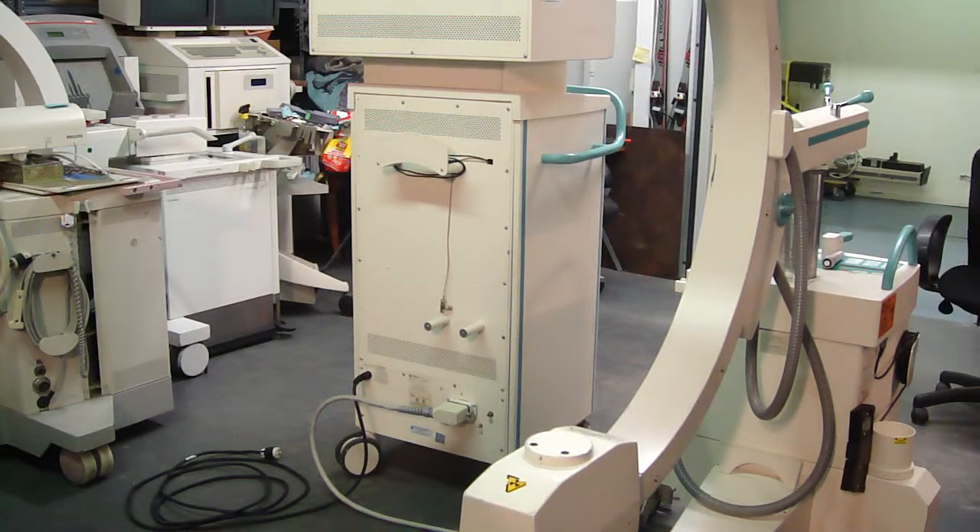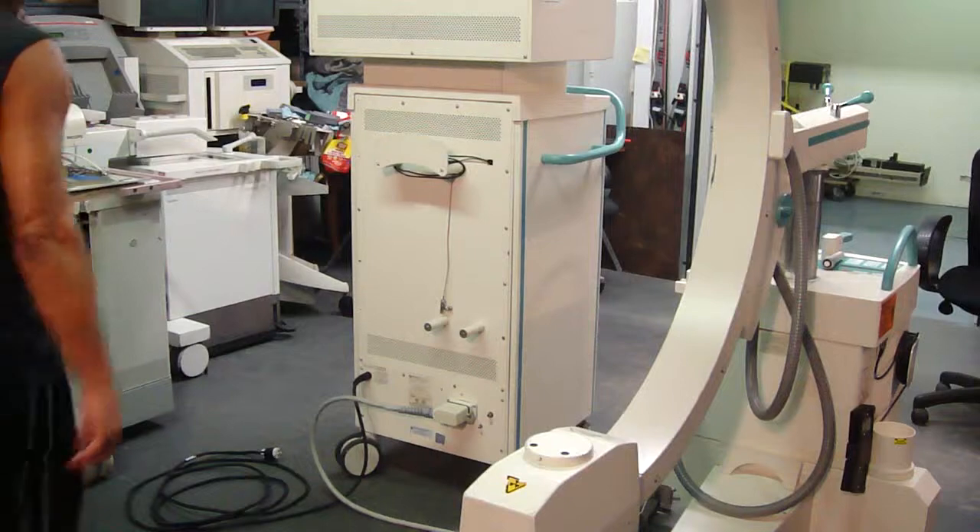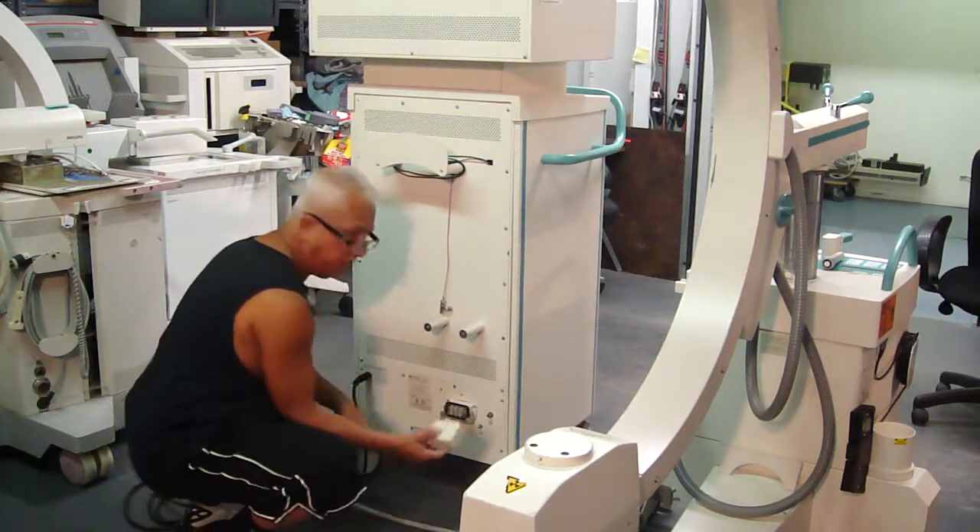This is a demonstration on how to properly connect and turn on the Ziehm Vision C-Arm, or a similar C-Arm. First, you have to connect the interconnect cable, which I have already started here.